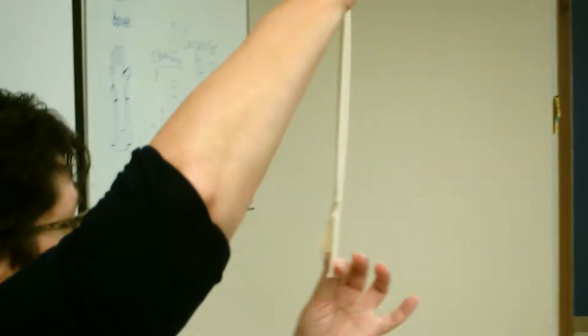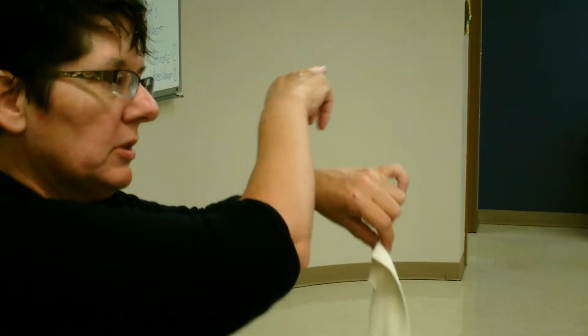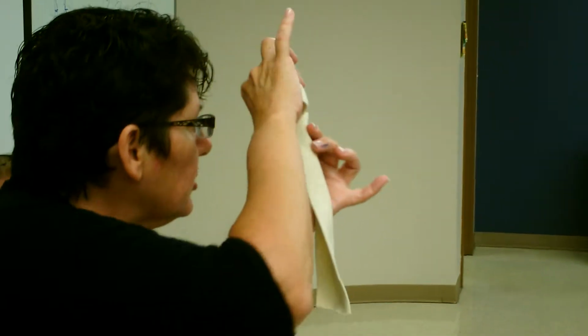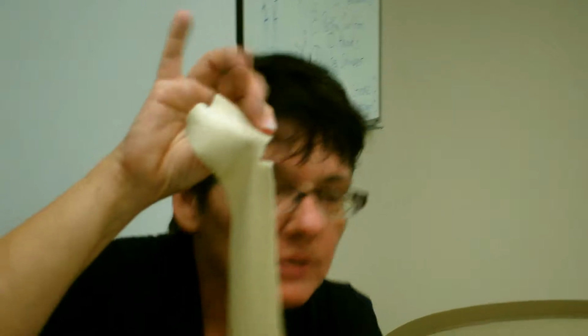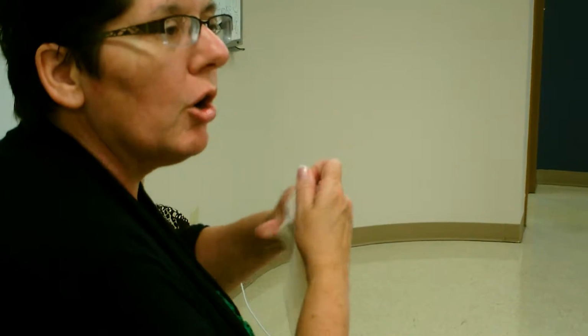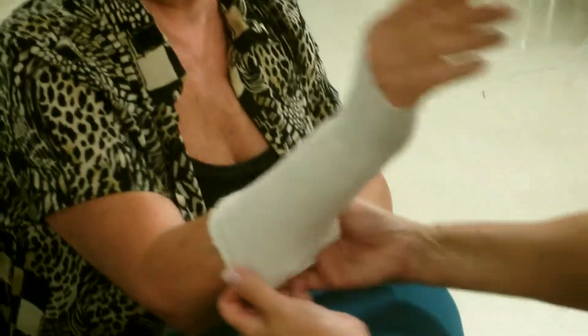So then you go, and the other thing you need to do before you splint any patient, there's this thing called the Stockinette. Okay? If your clinic doesn't have this stuff, an old tube sock will work nicely. Cut the thing off the old tube sock and cut you a little notch out of here. You see the little notch you do? Little notch, okay? And this is a sleeve that goes on the patient so you don't burn them when you make a splint. So this goes around their little thumb there. Do you see that? Michael, you got it? Yes, ma'am. All right, baby doll.